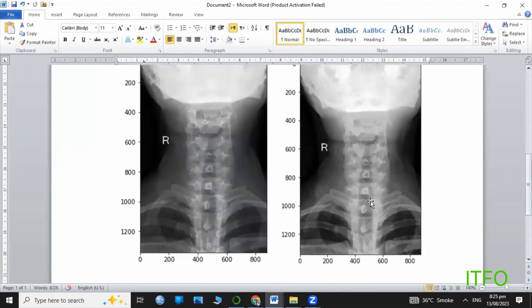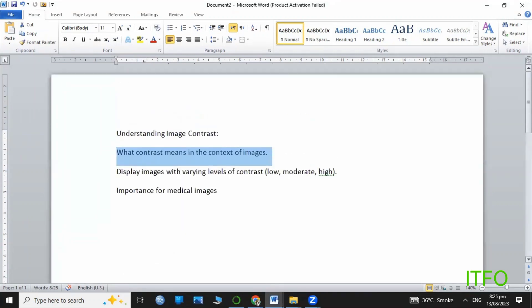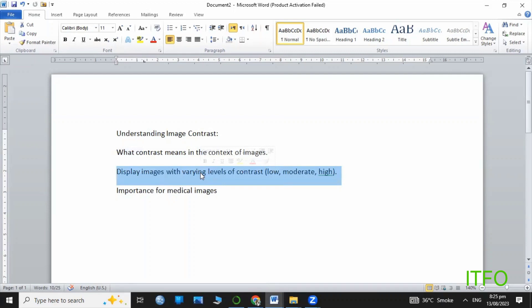In medical images, contrast refers to the difference in intensity between different structures in an image. High contrast images allow us to distinguish various tissues and details, leading to accurate diagnosis and better insights.